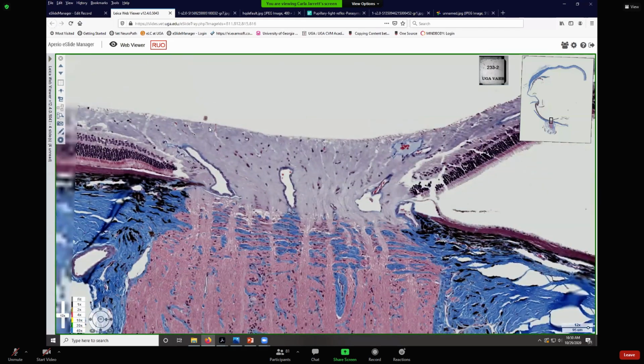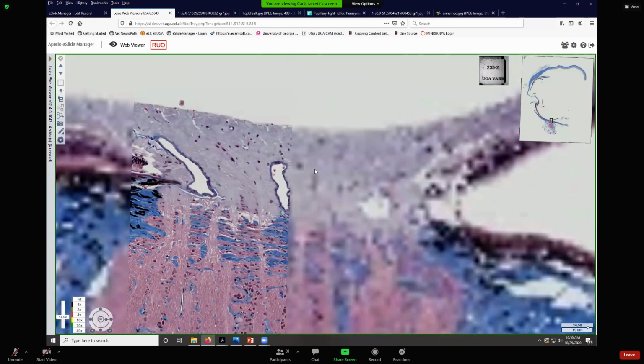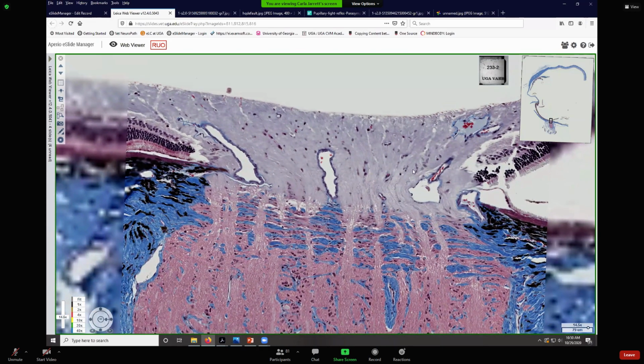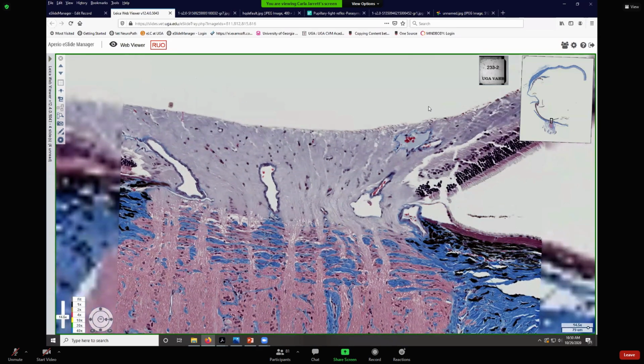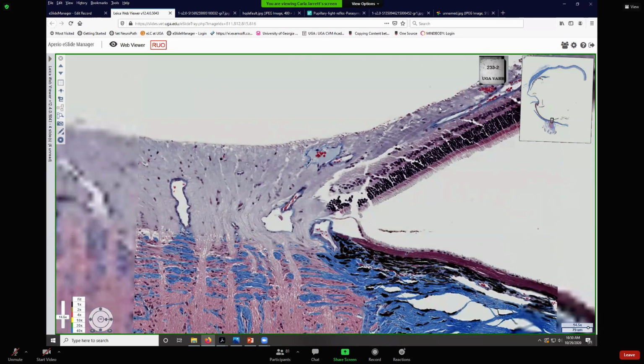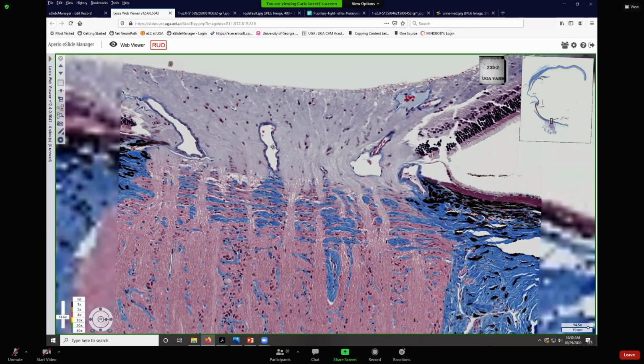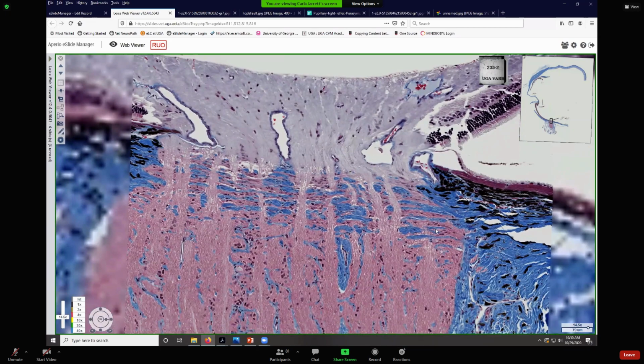Boom. Wow. This is going to happen. This is where all these axons of all those ganglion cells, all those multipolar neurons, their axons come together and form the optic nerve. Now they're unmyelinated right here because we don't need myelin in the way. We still need light to penetrate and get to these photoreceptor cells. So they're unmyelinated, they coalesce, they penetrate through the sclera.